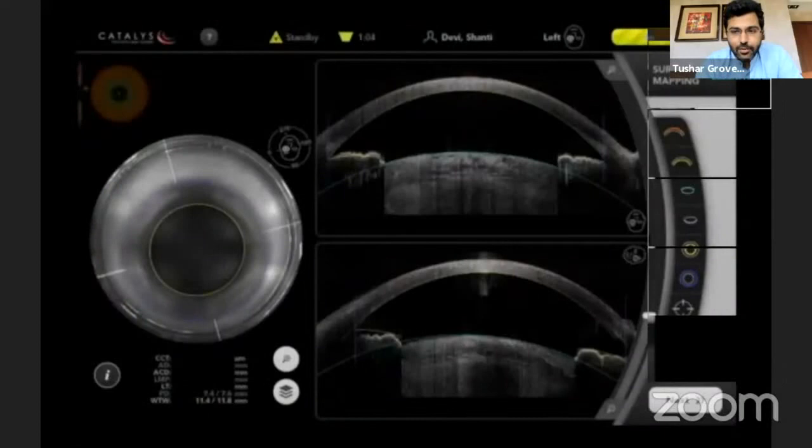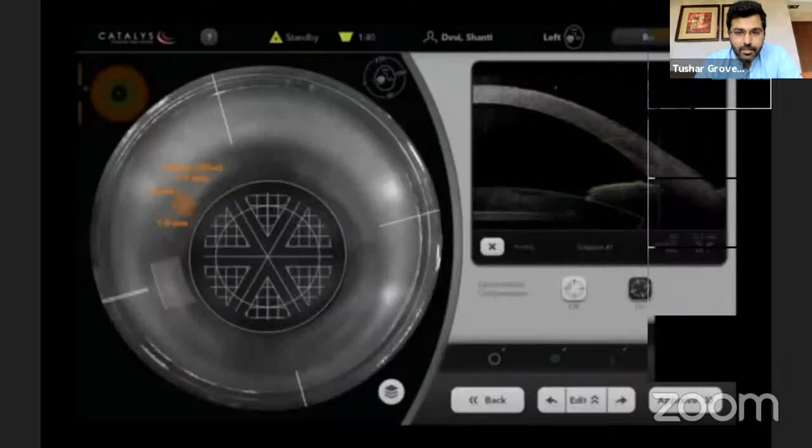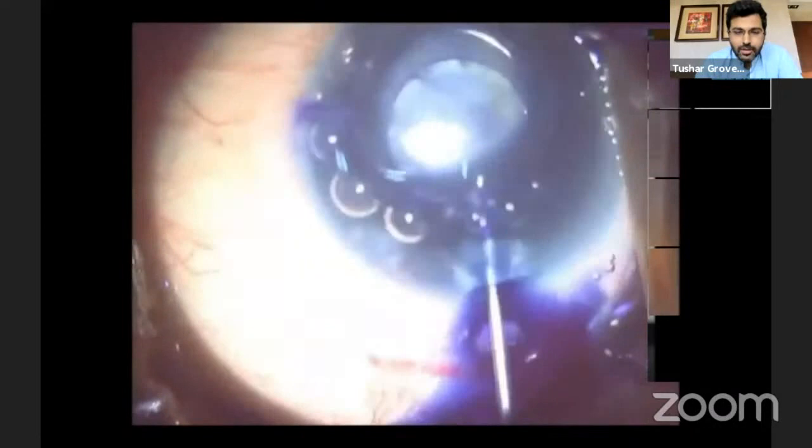Another situation where you can have these issues with capsulotomy is when you have white mature cataracts. We usually increase the energy settings and increase the depth of the capsulotomy in white mature cataracts because you can possibly have tags left behind — there is some milky cortex that is released at the time of capsulotomy, and it's quite common to have some incomplete capsule tags left behind in white mature cataracts.